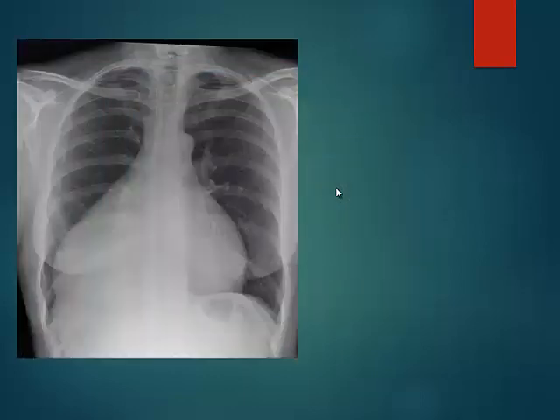Okay, what about this? Dextrocardia? Any other guesses? Right atrial aneurysm. So you're extending your right cardiac border further rightwards, making it aneurysmal. Okay. Anything else? Any other guess? Pericardial cyst. Very good. Okay. So what would you do next?